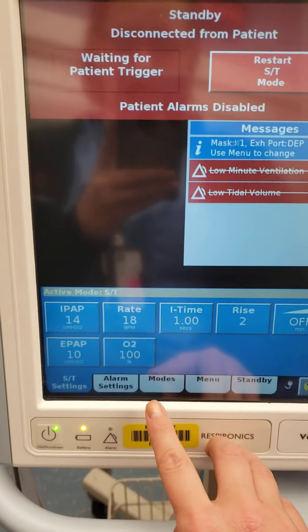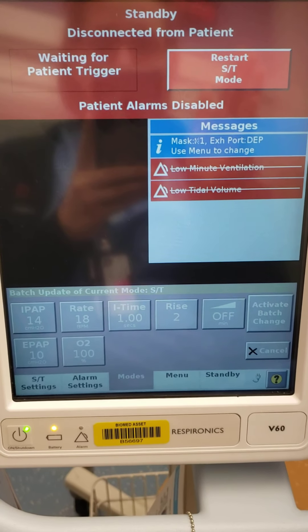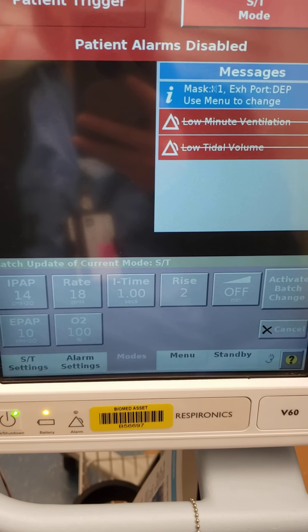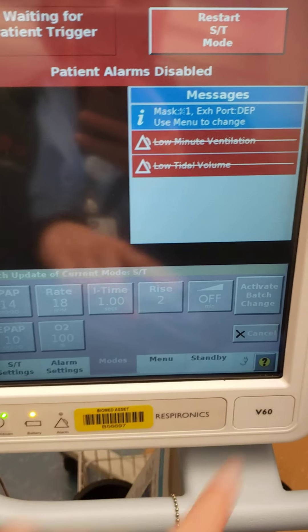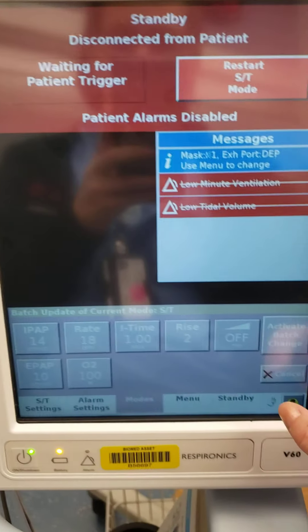Other modes include BiPAP ST, which stands for spontaneous-timed. This is our classic BiPAP setting. This is where we would set our IPAP, our EPAP, our rate, I-time, rise — all that. And then activate batch change, which means it will activate all the settings you put in to be ready for the patient.